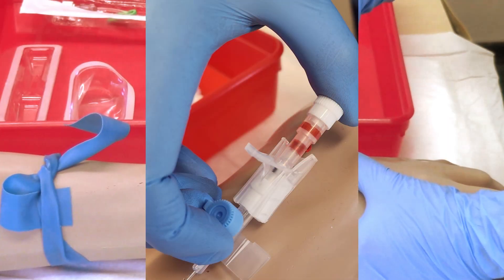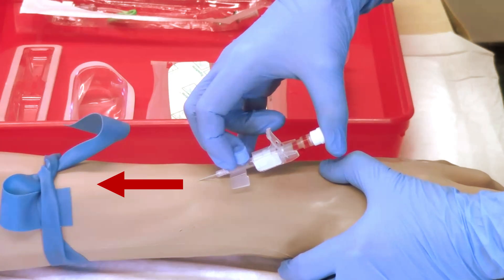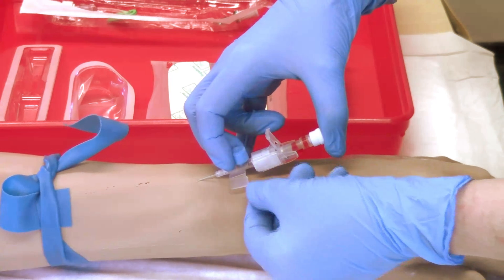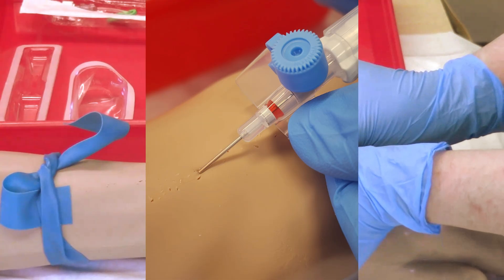Insert the cannula through the skin at an angle of 10 to 30 degrees with the bevel of the needle facing up. Once flashback is seen in the chamber of the stylet, reduce the angle of insertion and advance the cannula slightly to ensure entry into the lumen of the vein. Withdraw the stylet slightly with your dominant hand until a second flashback is seen along the cannula shaft.